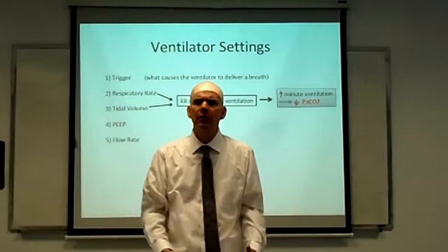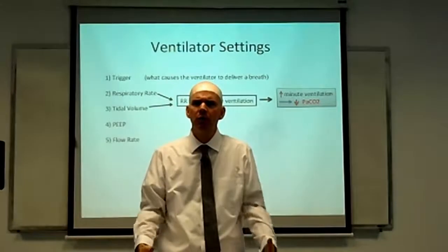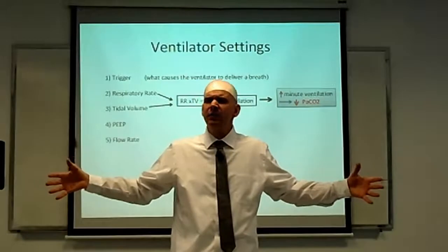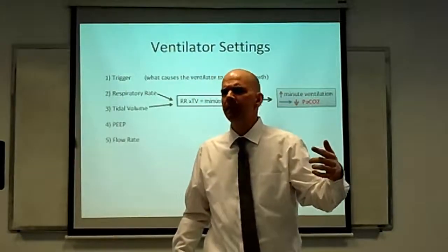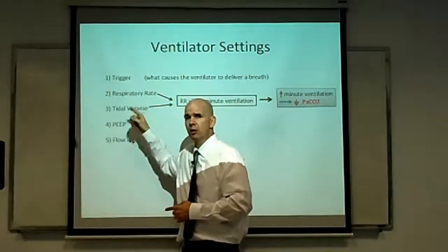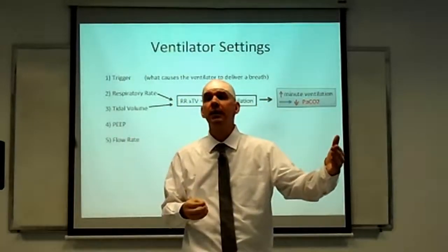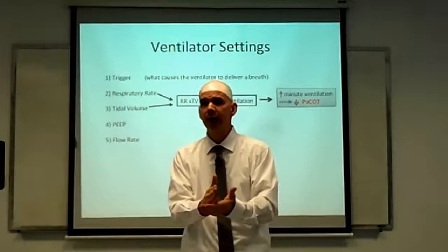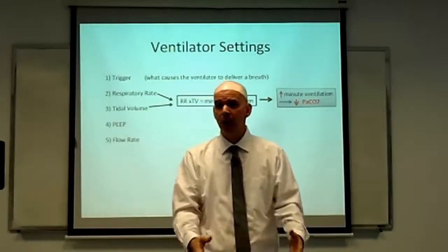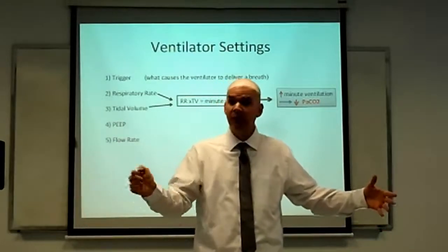If the flow rate is slow, that tidal volume is being delivered slowly, and it takes a long time for inhalation. That's a problem, because if the inhalation takes a long time, I have less time left over for exhalation. Remember, we're working at a set respiratory rate. We're on a clock here. Say I'm working at a respiratory rate of 15 per minute, I've only got 4 seconds total for each breath. If the flow rate is slow, making the inhalation take a long time, then there's less time left over from that 4 seconds for the exhalation.